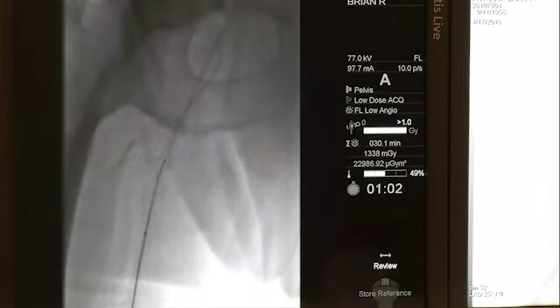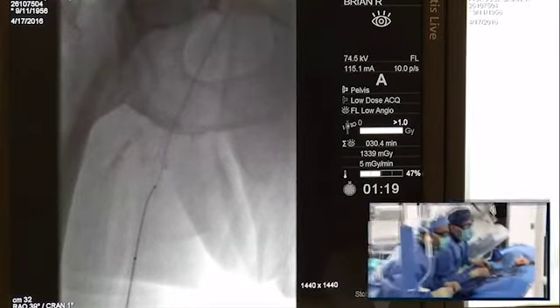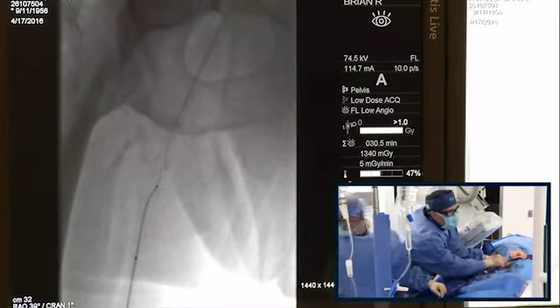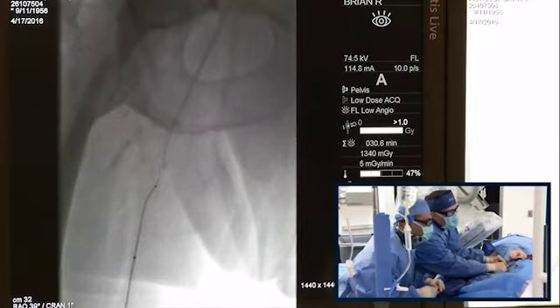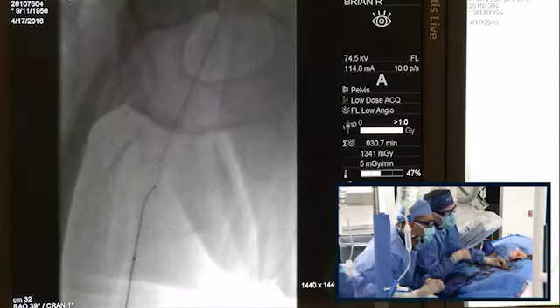Andy, come over here. Put it on. Pull the thing back. Navicross back. Put it back, Andy. So I'm just going to try this for a second. Can you rotate that one? See if you can rotate it a little bit. Yeah, okay, that's good. So we try this for a second.